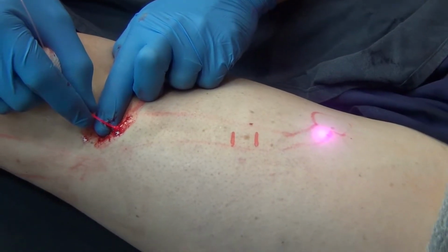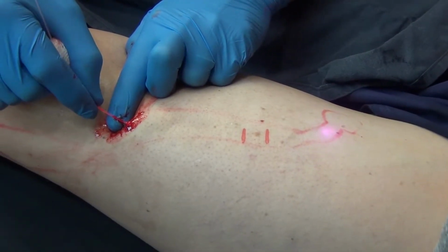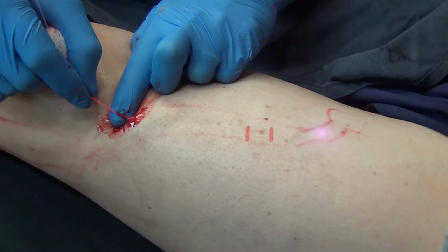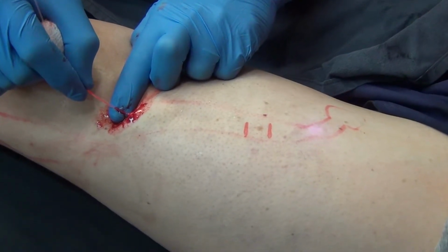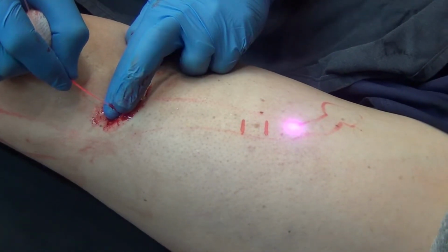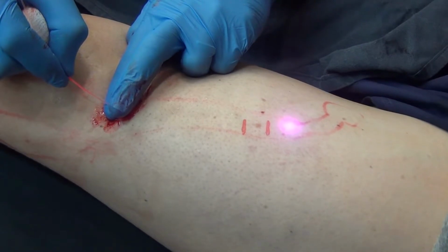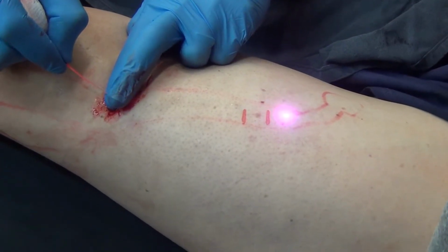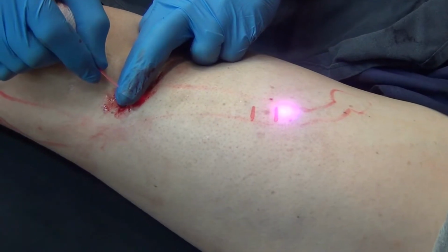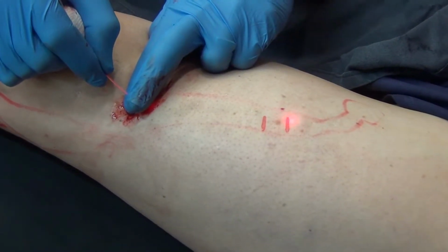Using 12 watts of energy, we're going to ablate the varicose vein, avoiding the area between the two marks, which is where our arteriovenous anomaly was found. Stop.